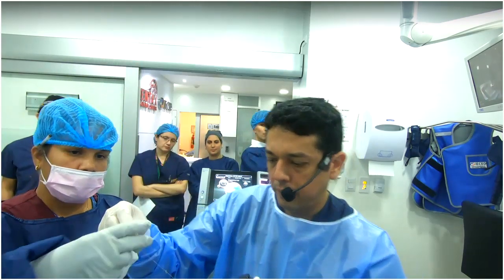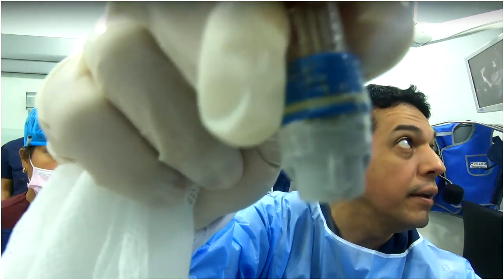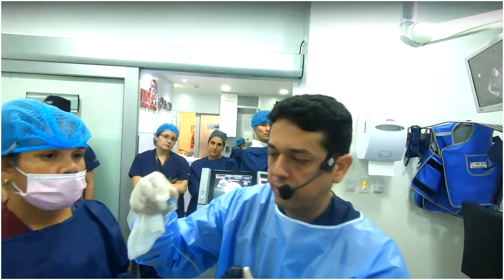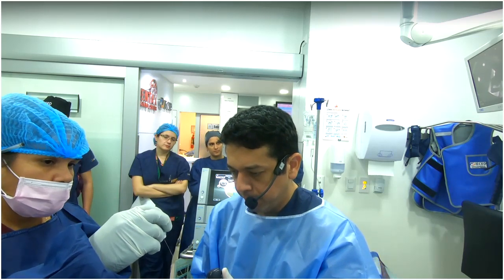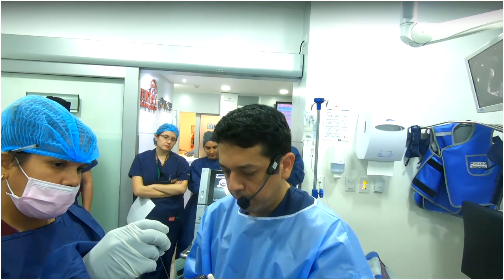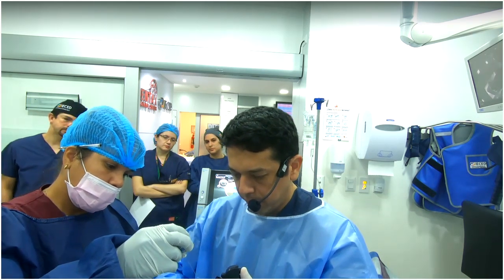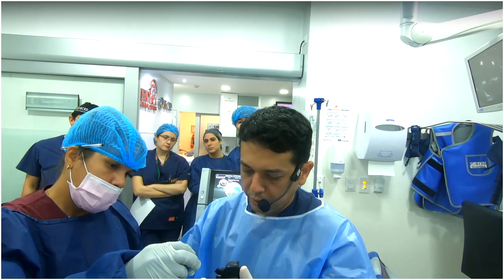It's very important to see this sign, because this part needs to be adjusted in the working channel.